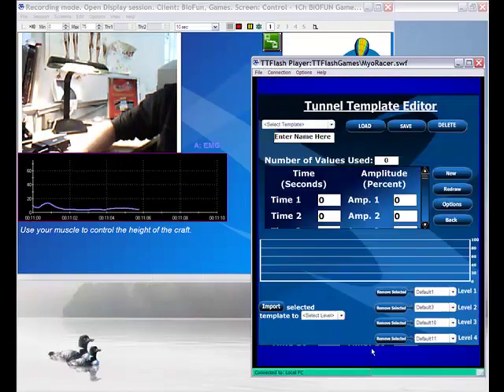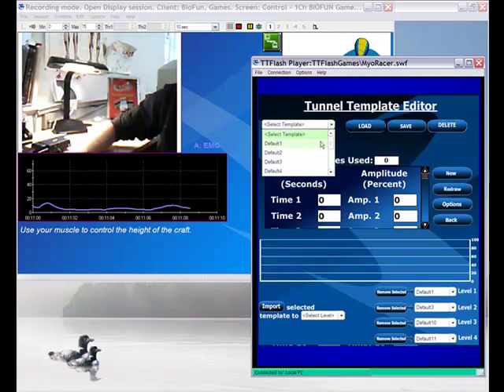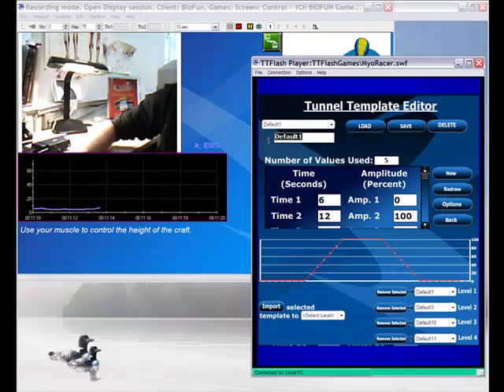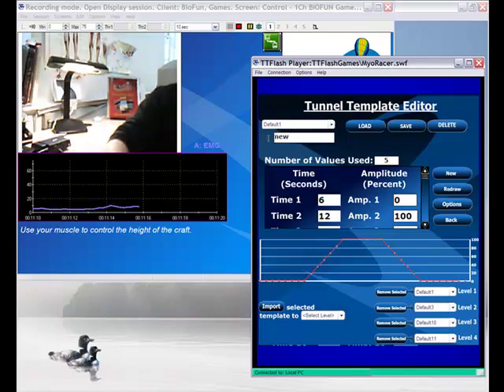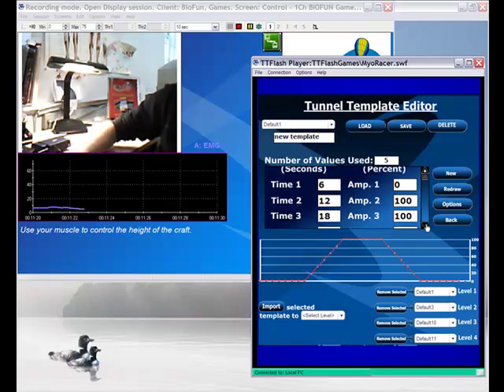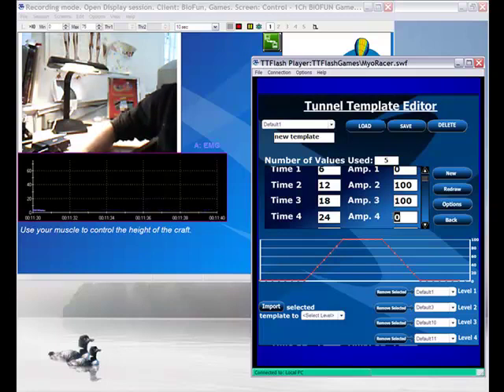A cool feature of the game is you can customize it. We have what we call a Tunnel Template Editor, which is basically a way to change the path and actually the contraction pattern during the game. So here we can create a new template based on an old one. And I'm gonna change time for amplitude 4. Instead of 0, I'm gonna put 100.